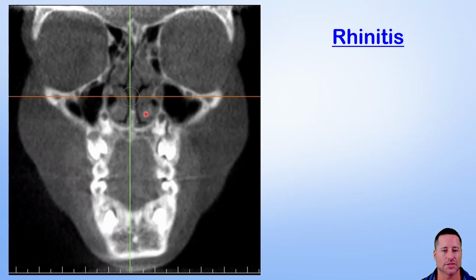Another example, you just see that inflammation throughout the nasal passageway. Once again, narrow arch, posterior crossbite, high vaulted palate, insufficient space for the tongue. And maybe it could be because they can't breathe through their nose, they're not growing as wide, as we've talked about, right? And that's one of the things that we go into in a lot of detail. The courses go into that a lot, but the future podcasts coming up, 2 and 3, will go into that in significantly more detail. So kind of keep these images in mind as we go into those later podcasts.